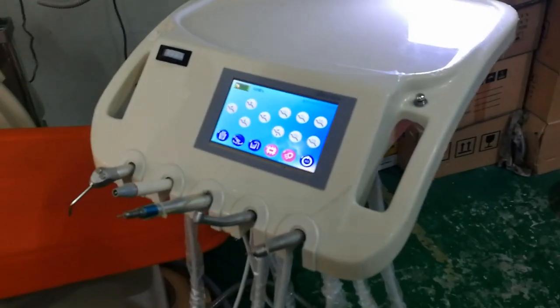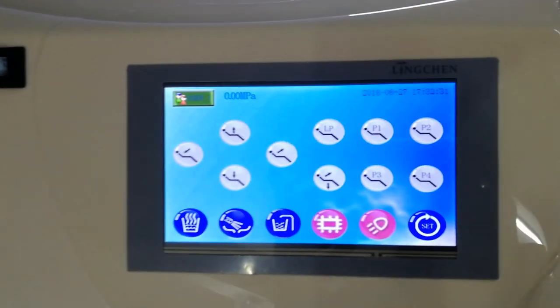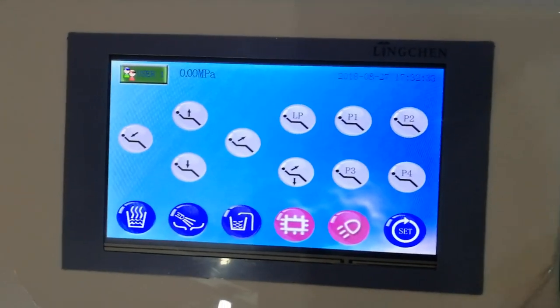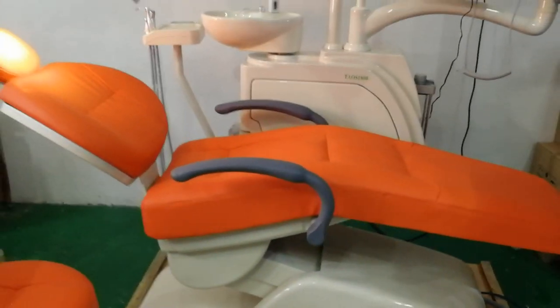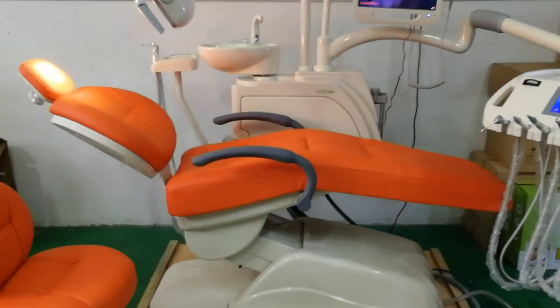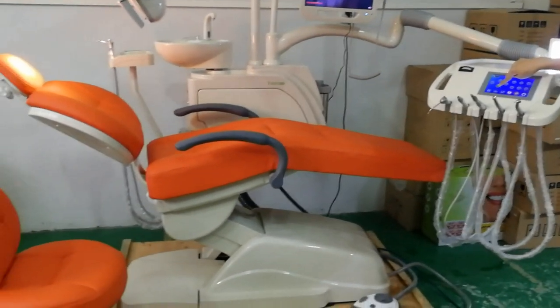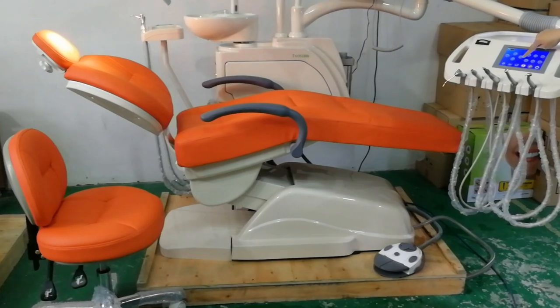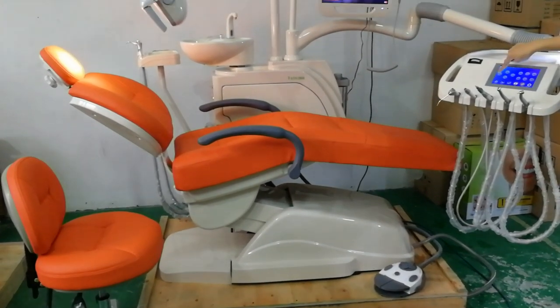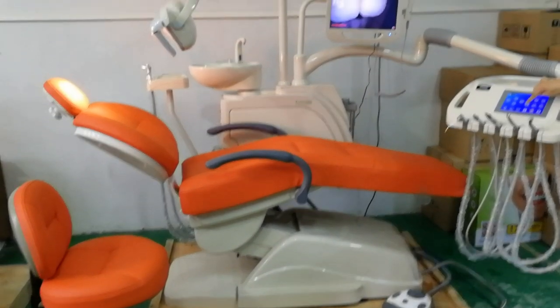We will see the operation tray on this chair. It is with a touch control system that controls all the chair's movements — fold up, down, backrest — and controls the length and the X-ray lever. You can see it is working very smoothly.